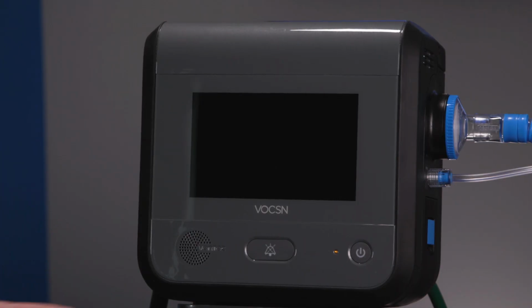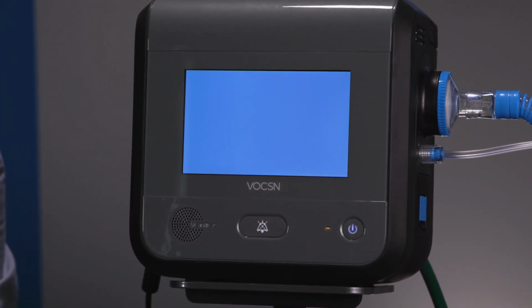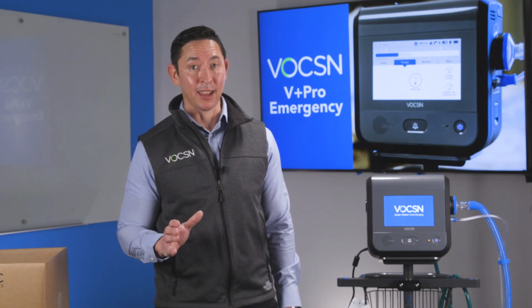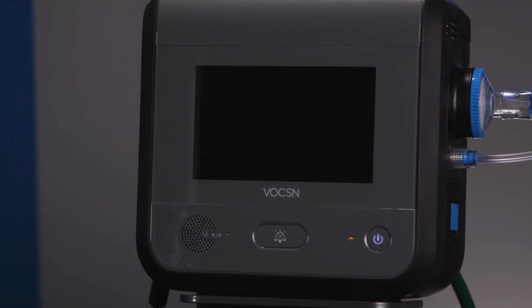So I'm going to spin the device around to the front. I'd like to show you the alarm silence button right here and then our power button. Just press it once to turn it on. And as VOCSN turns on, you're going to hear a couple of loud beeps. That's okay. That's the in-op alarm testing itself. There's those beeps.